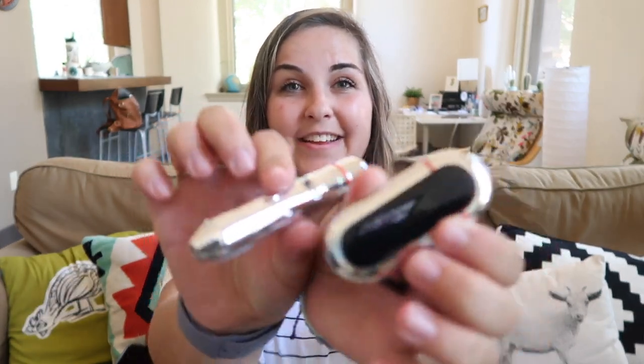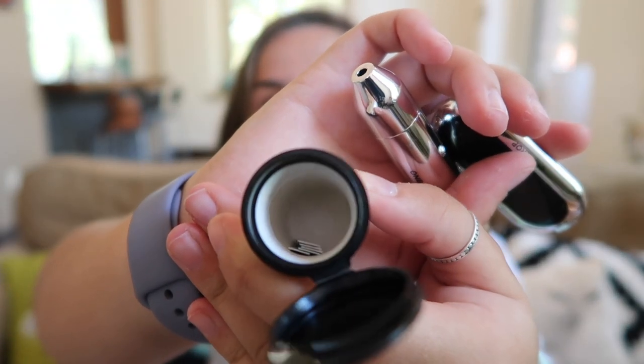I also have the almighty glucose monitor. I use the One Drop — I love it because it's so tiny. I don't use the case that goes with it, and I actually need more strips. There are like no strips in there. But yeah, everything that goes with that: pricker, meter, and strips — which I need more of.